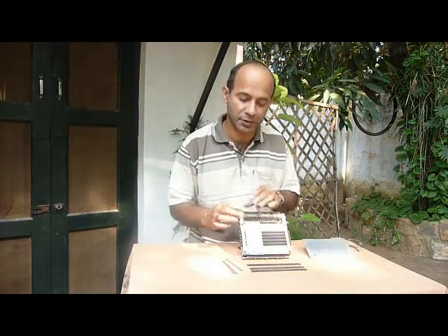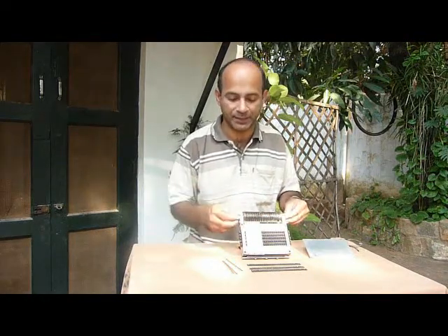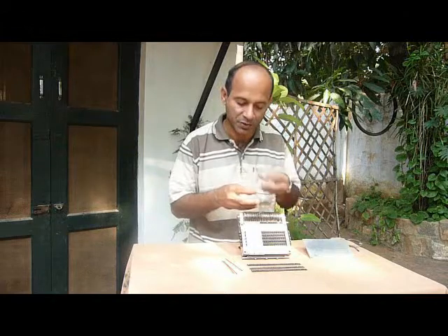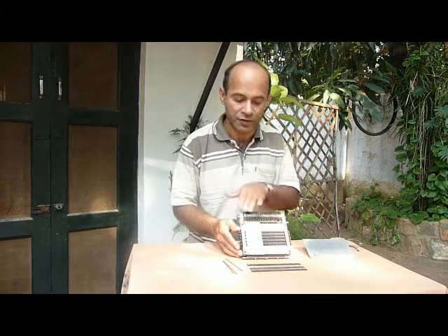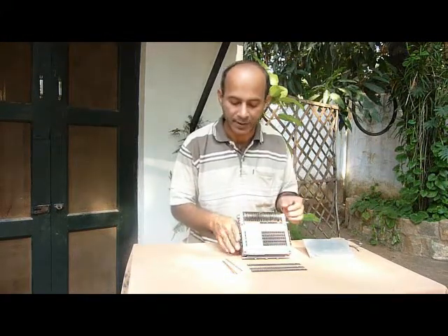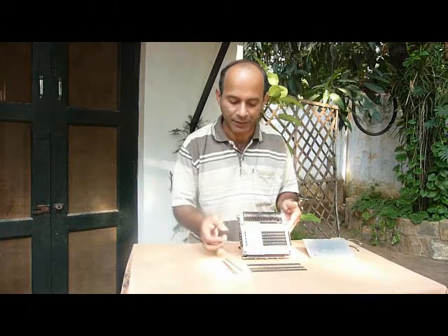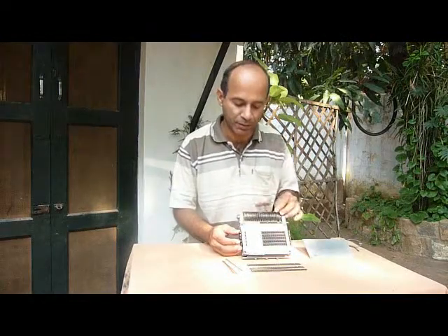I'm not using individual actuators, which will be too complicated, not complicated so much as space consuming. Whereas by having a bank of cams, which will be finally controlled by a stepper motor, you've just got that little motor there, or even if you split the bank of cams into two or three, you've got just two or three stepper motors to control for the columns, whether it's 40 columns or 80 columns or any other number. And I need only 15 actuators here, electromagnets of sorts, to control the 15 rows. So that's a significant reduction, just 15 actuators and one cam controlling stepper motor to control 600 pins.